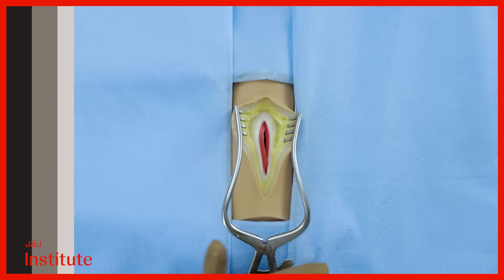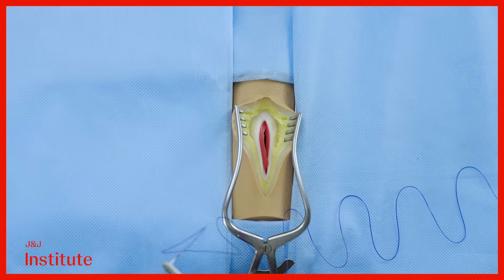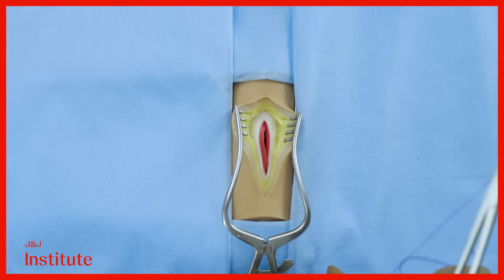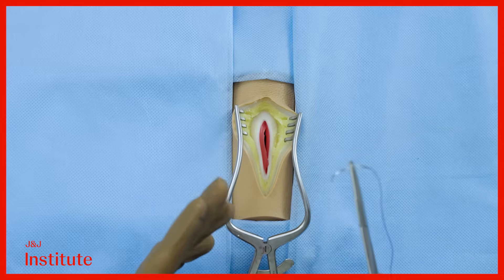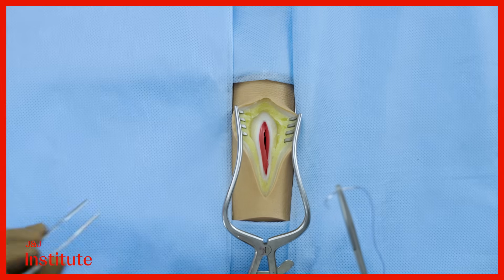For this demonstration, we will be using a size 0 polydioxanone suture that is coated with triclosan, also known as PDS+. We have the suture on a round body needle for the closure of fascia.